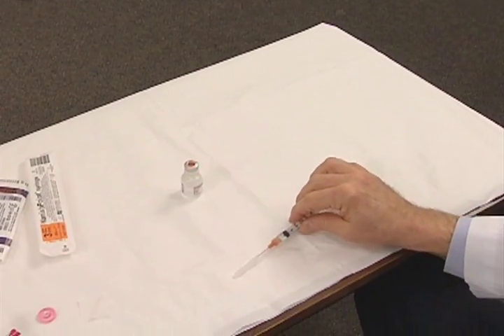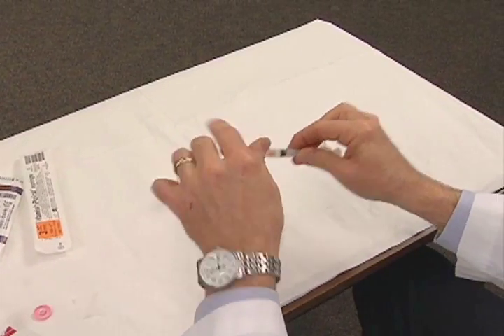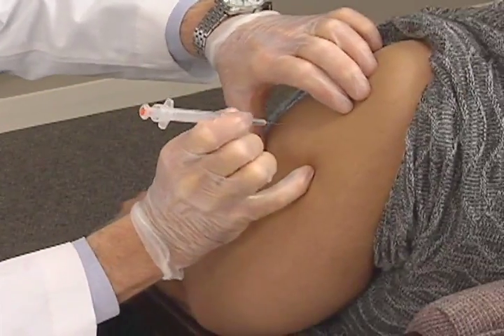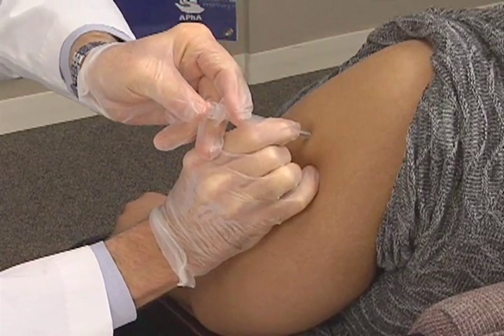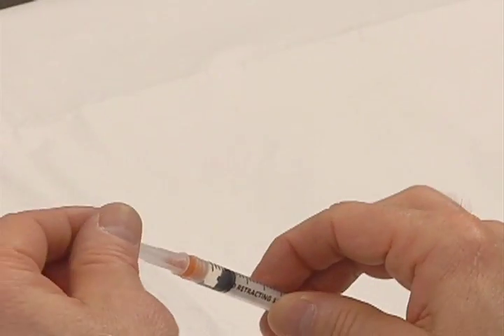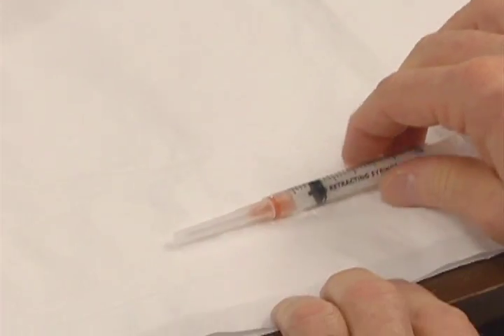At this point, you may do one of two things: recap the syringe for later use, or inject the vaccine directly into the patient. If you are not injecting the vaccine right away, you may recap the needle, as it has not entered a patient and is still sterile. Never recap a needle that has been inserted into a patient.